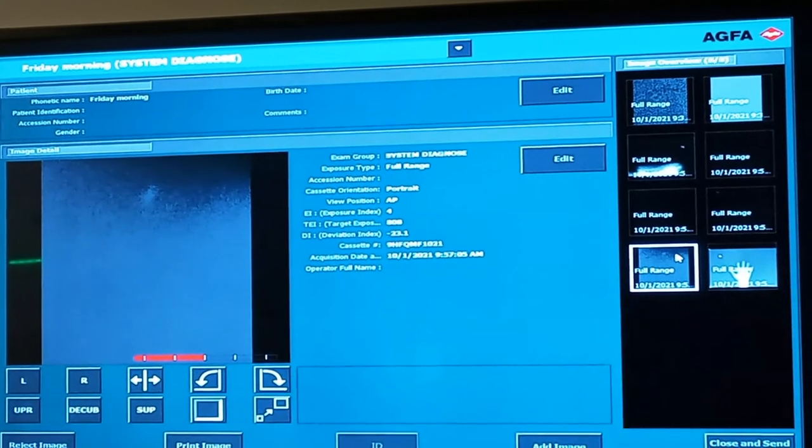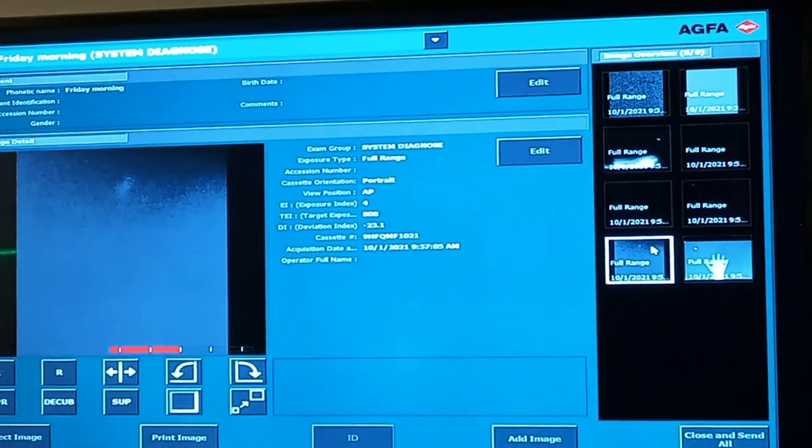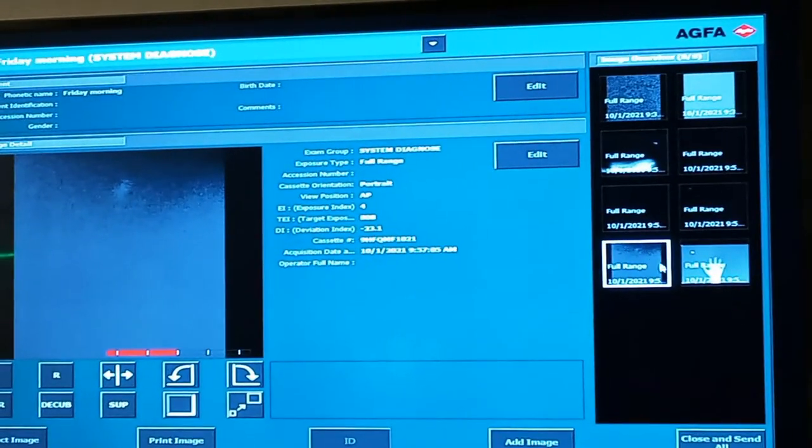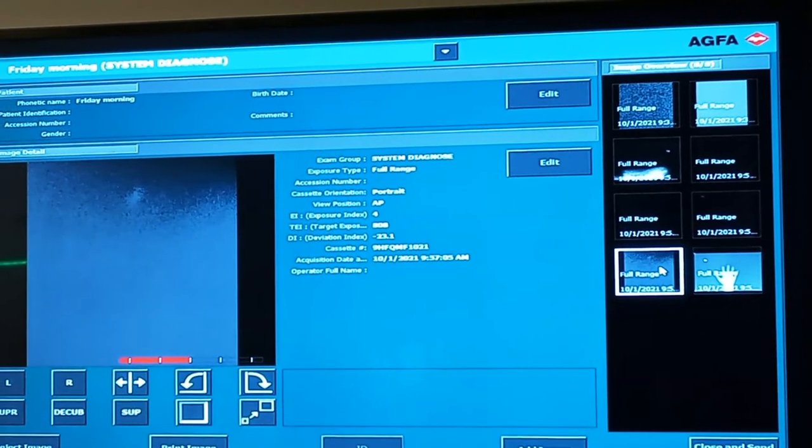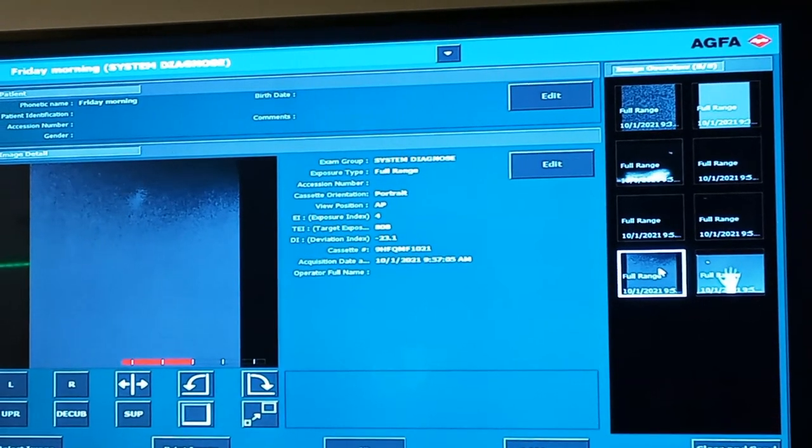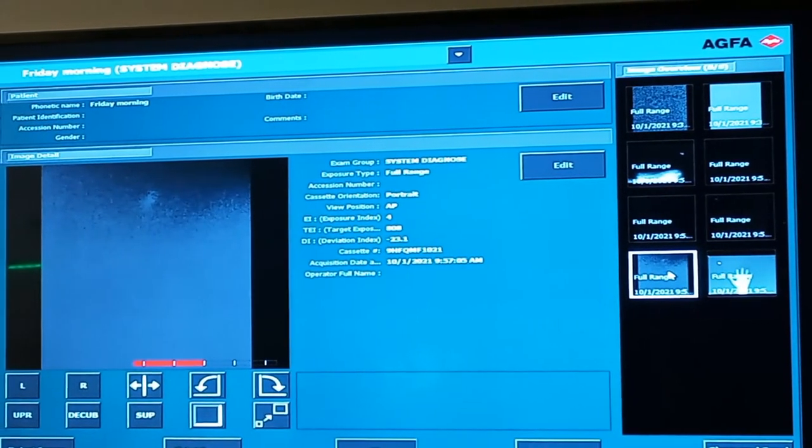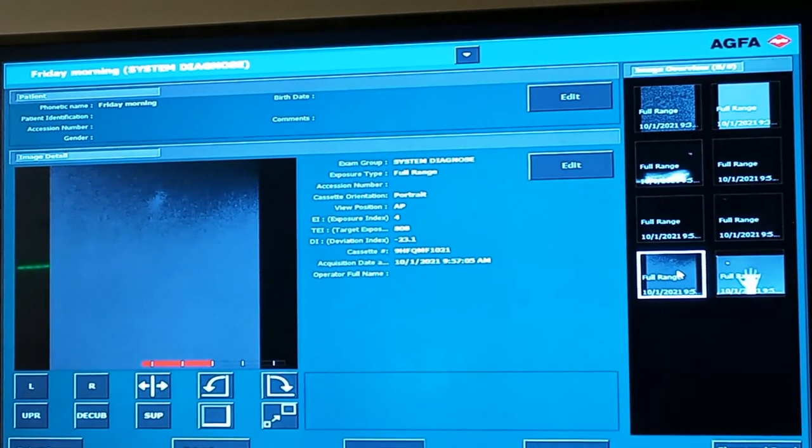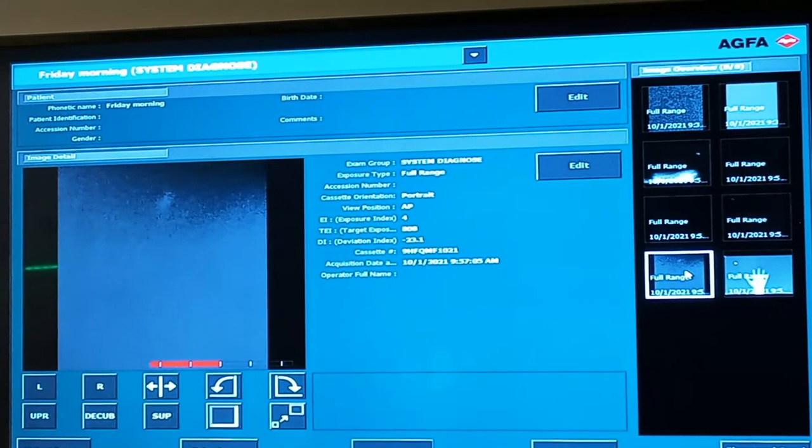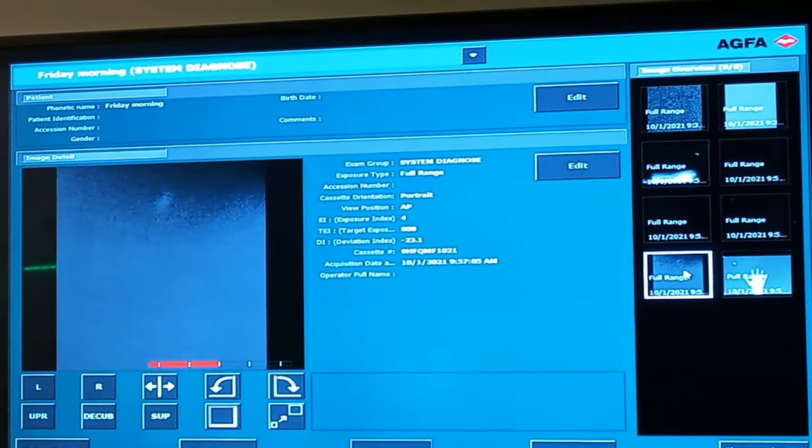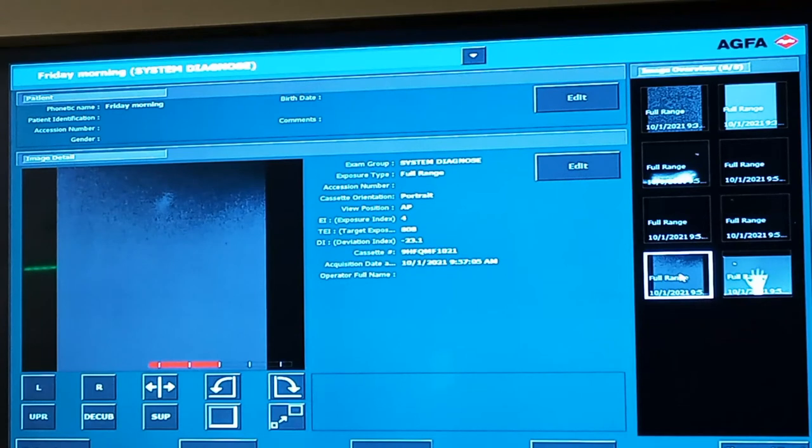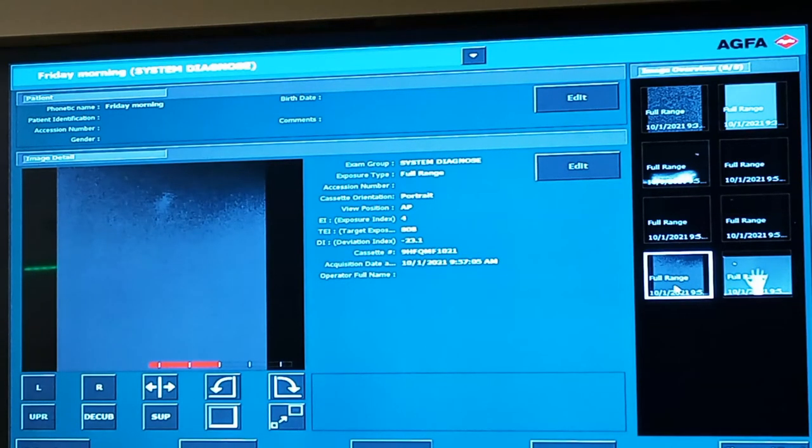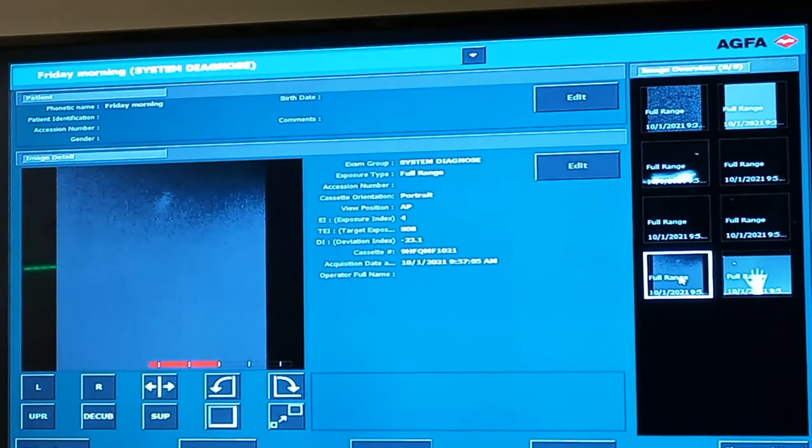Okay, well, this is interesting. So we had a skeleton with an apron on with this image receptor, and this thing was six feet back from the patient, from the ISO center. So if you're in the room and you're standing back from the patient, still a good idea to put on your lead? Yeah, big time. Because if we were just going to shoot one x-ray and then split, it wouldn't be that big of a deal. But we're sticking around. We're shooting maybe 15, 20 x-rays over the course of a day, and it adds up.